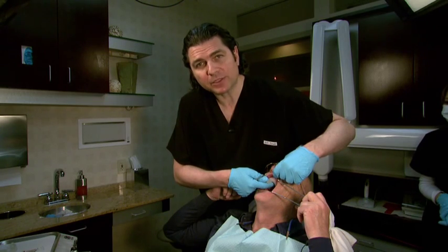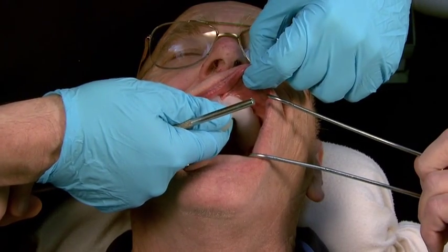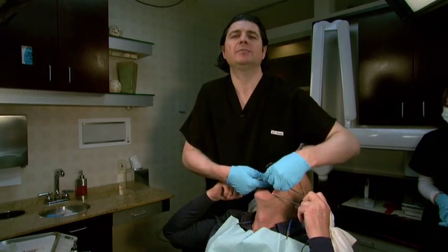The most important aspect to evaluate are the border extensions, the flange extensions. They need to be two to three millimeters short of the mucobuccal fold. Frenum areas need to be relieved.